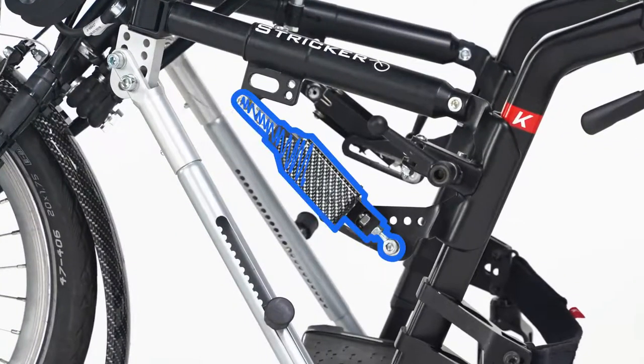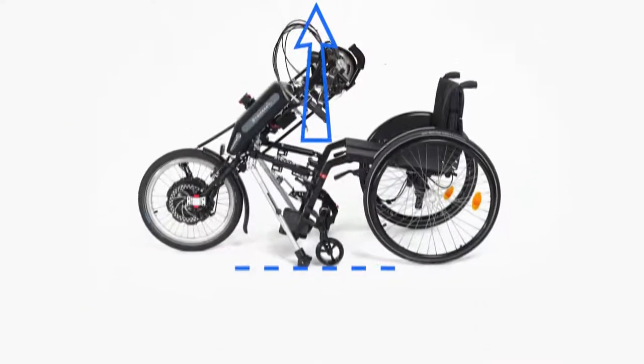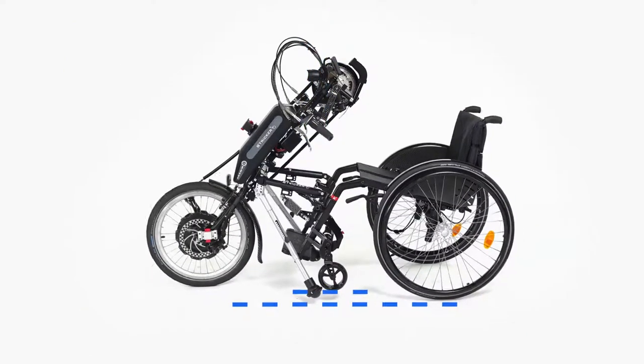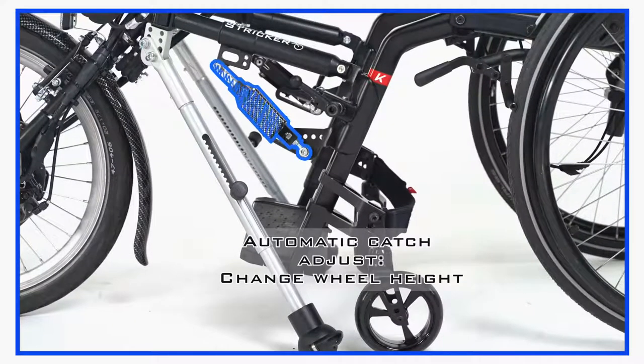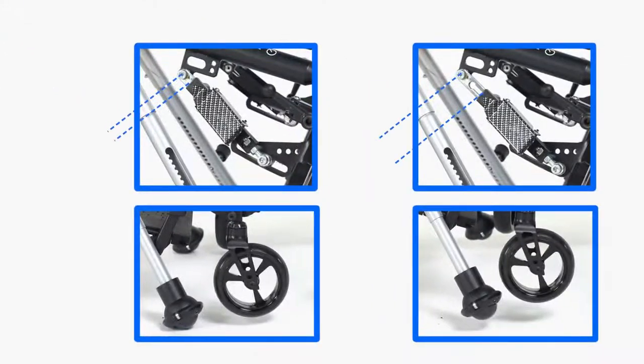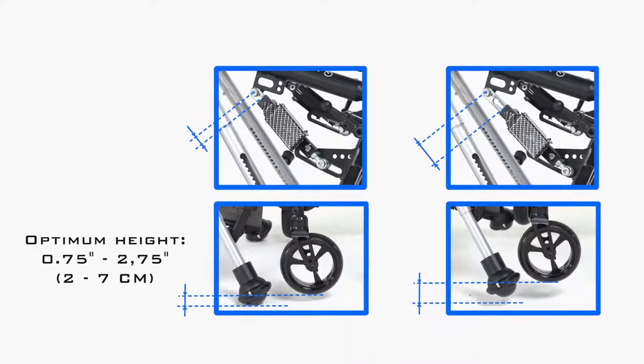The automatic catch mechanism ensures that the wheelchair wheels lift off the ground and determines the ground clearance of the frame. To change the height of the front wheels, we adjust the automatic catch. The height can be adjusted by loosening the screws on the automatic catch and moving the carriage. The greater the distance of the slide, the higher the ground clearance and the rearward tilt of the wheelchair will be. The optimum height of the front wheels is between 0.75 inches to 2.75 inches.